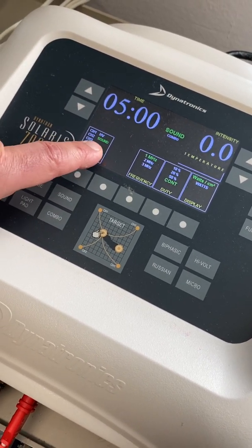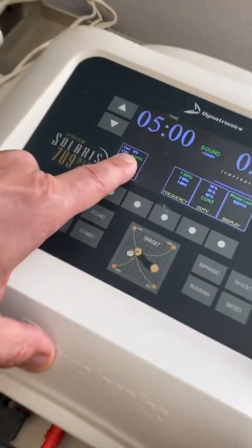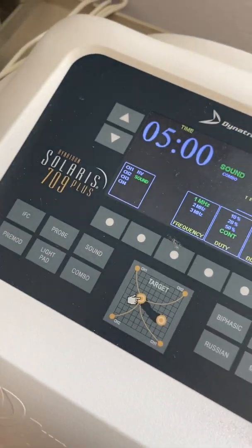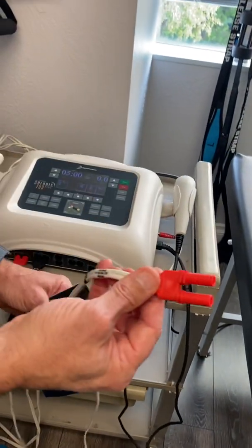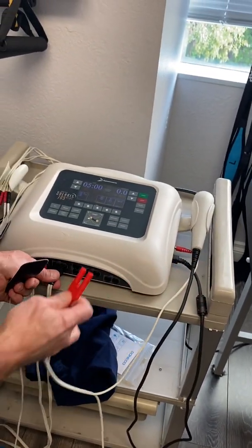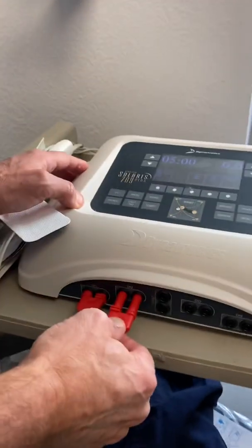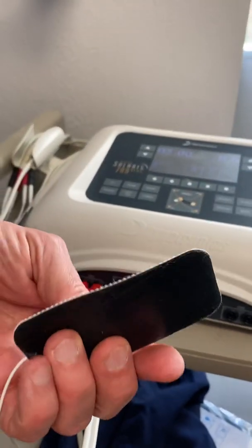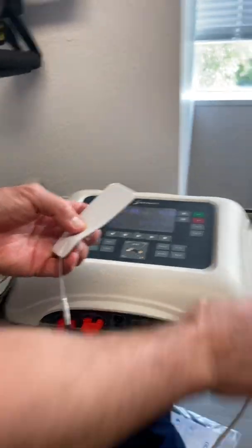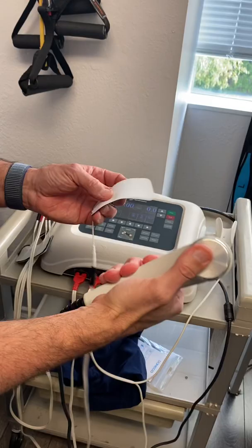And then over here, you can see that the sound head is actually attached to channel number 2, which is here. So this is super important. You take this, which is attached, this is the ground for the ultrasound, and we take that out and we plug it into channel number 2. So now this ground pad, when we put it on the patient, it's going to be active, and the sound head will be active for electrical muscle stimulation.